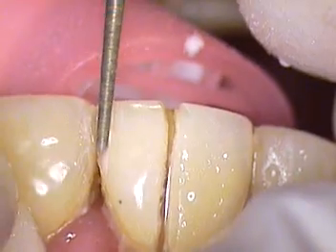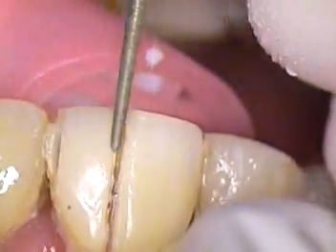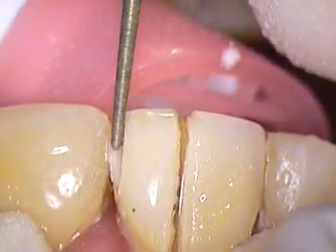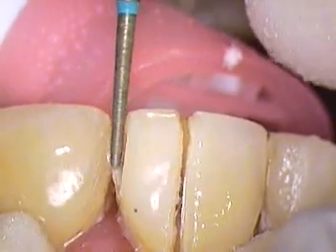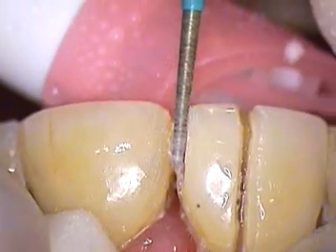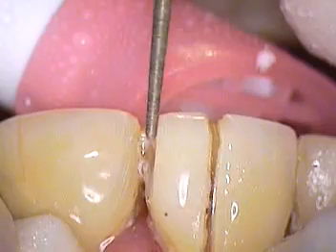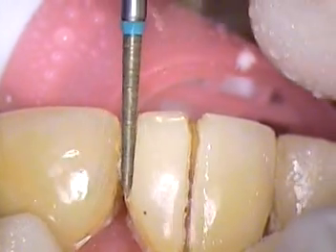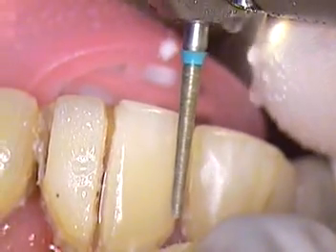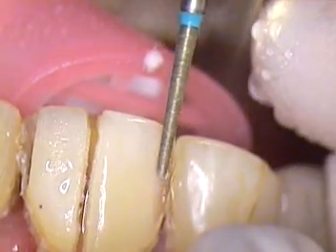From an orthodontic standpoint, this central incisor is out a little bit, so we'd like to bring it in and possibly match the adjacent tooth. We can also bring number 9 out, which is the left central incisor. And there's the enamel right there, so we'll stop at that point. Come over to this side, and we'll just repeat the process.